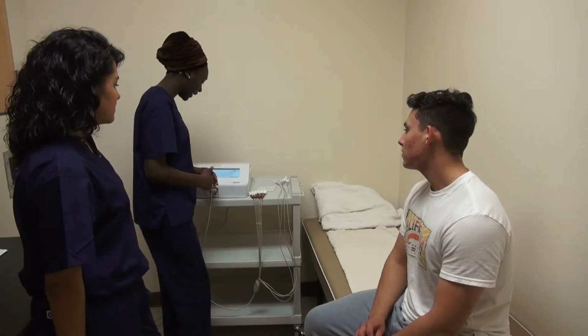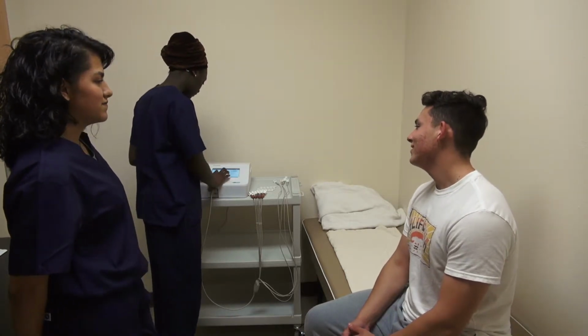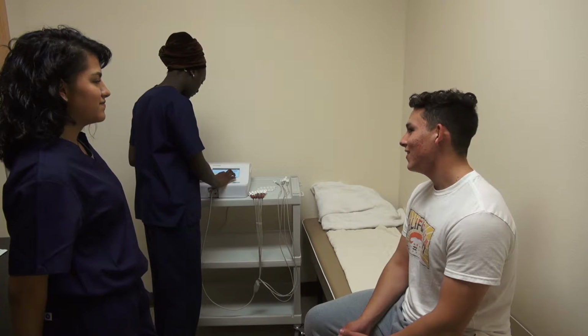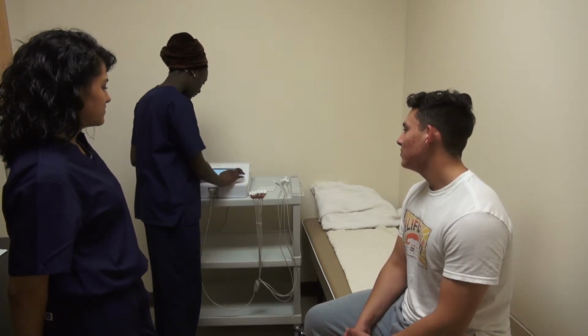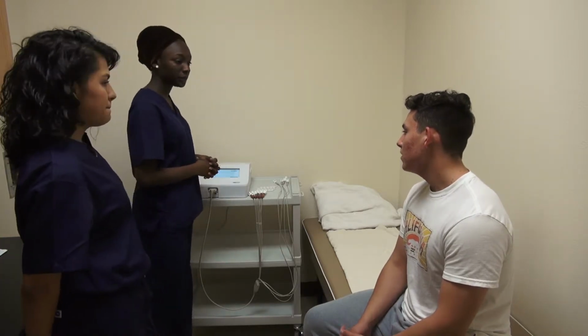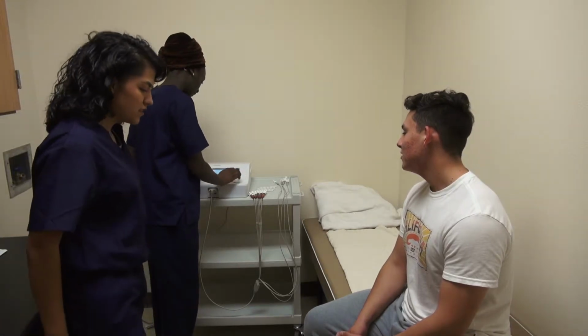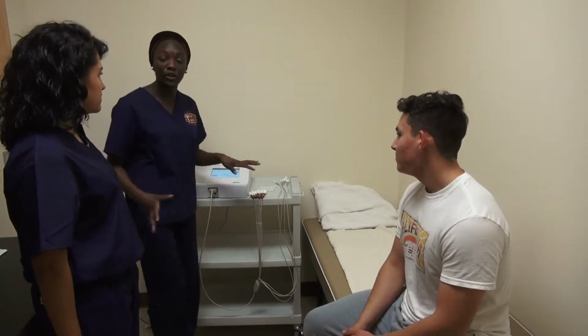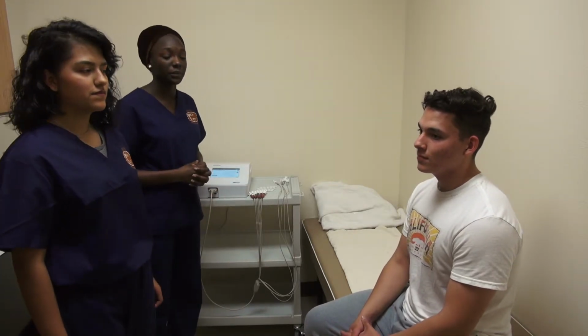Okay. And now will you please state and spell your first name? Brandon, B-R-A-N-D-O-N. Okay. And now your age? 17. Okay, and now once we've entered in the patient information, we can then begin the EKG.